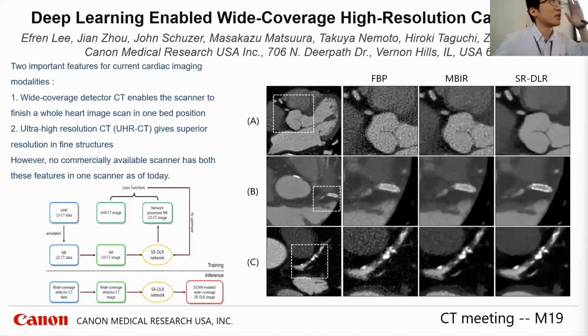So here we think very straightforwardly. We use the ultra high resolution CT as a learning target and apply it on the wide coverage, normal resolution CT imaging modality, and we can see the IQ improvement.